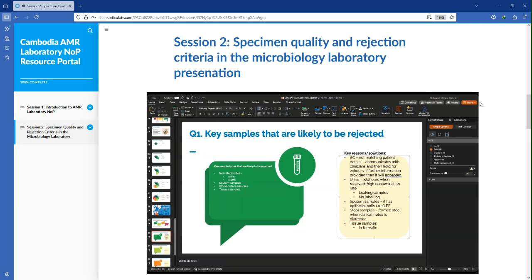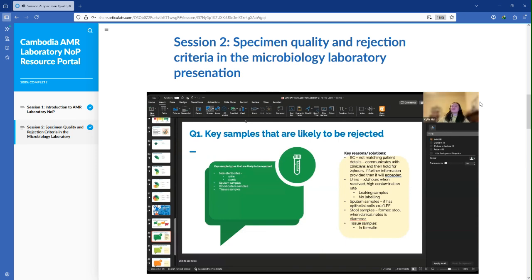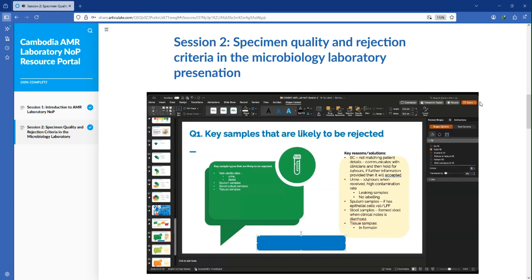We suggest recollecting again, but we have to provide instructions for the nursing staff or the physician on how to collect the urine culture correctly. We can also tell them to collect in the morning, and how to clean before collecting the urine.